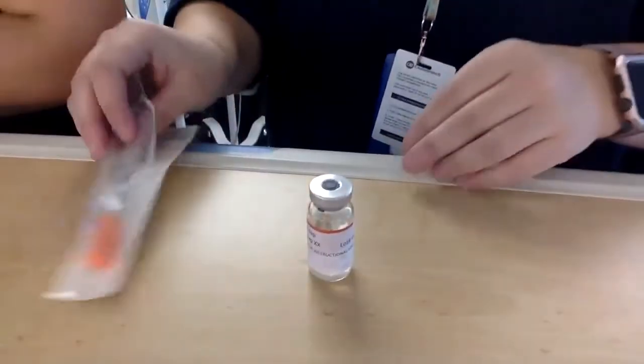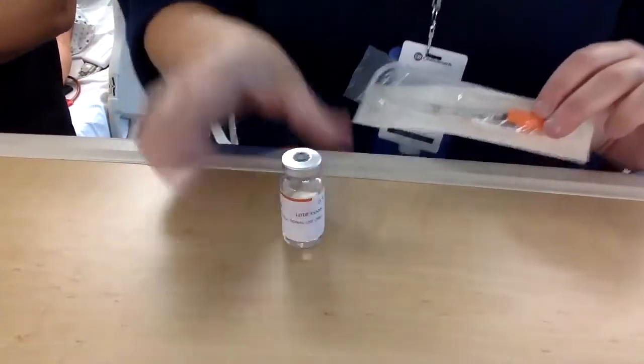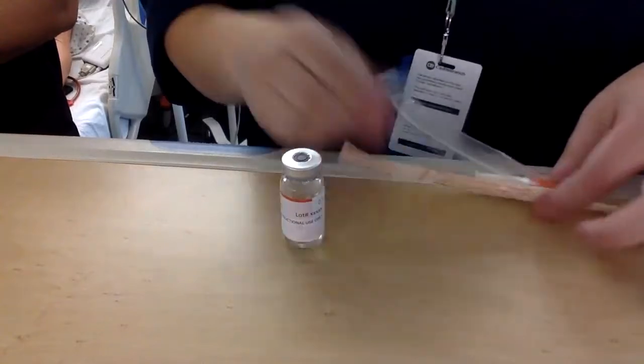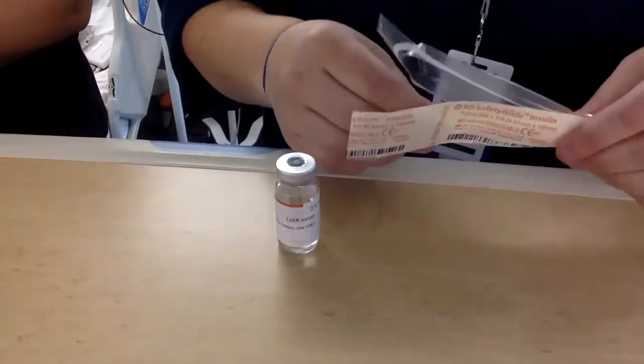So here, first, I have my insulin syringe and also my insulin. Then, of course, I'm not going to go deep into sliding scale. Don't worry. If you're in my theory class, you'll get to learn all about it. But I need to know how much I need to give. So let's say that I need to give 2 units. It's life-saving. A lot of people get it.